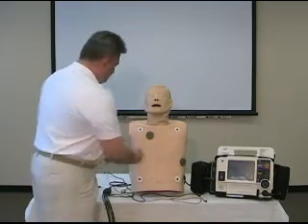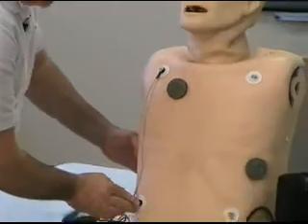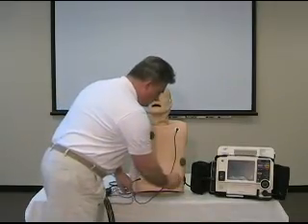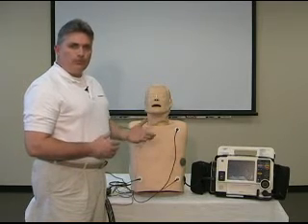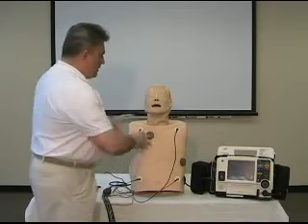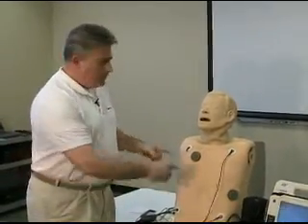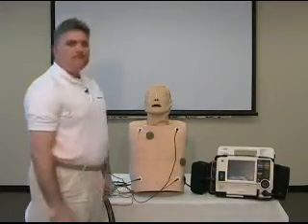Right arm. Right leg. Left arm. Left leg. Again, these 4 basic cables represent your limb leads. Leads 1, 2, 3, AVR, AVL, and AVF. Again, if you put them on the torso, that's okay. Make sure that they're furthest away from the heart if at all possible. Ideally, the arm leads need to be on the deltoids and the leg leads need to be on the limbs.